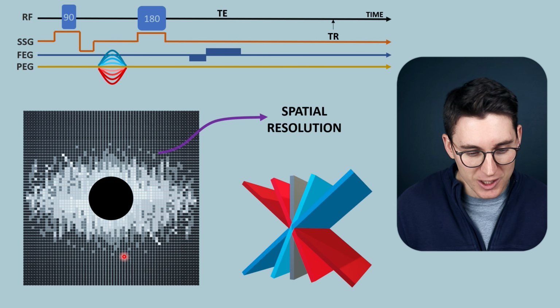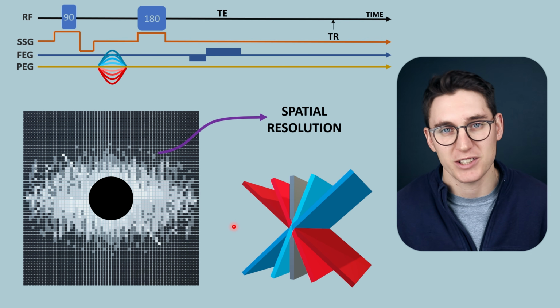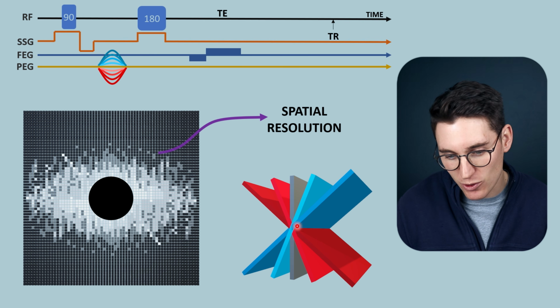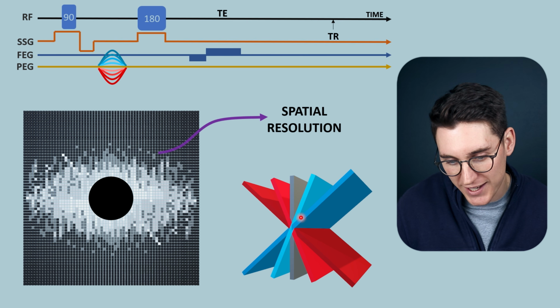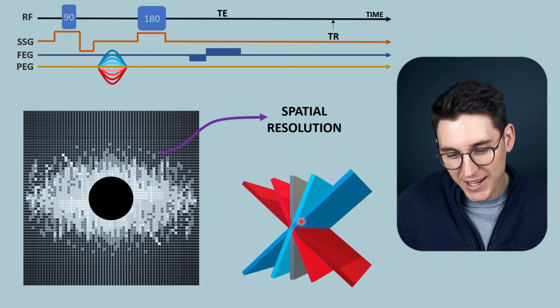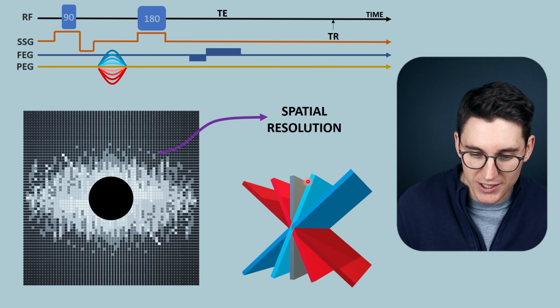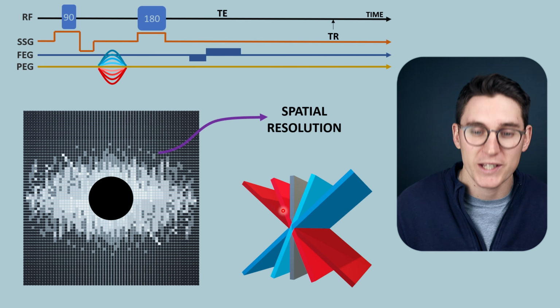Now, you may hear that the peripheries of K-space contain what is known as higher frequency information. The way I like to think about this is that the rate of change of phase, or dephasing, that occurs with stronger phase encoding gradients is much higher as we head up the y-axis than the rate of change at phase encoding gradients that are weaker.